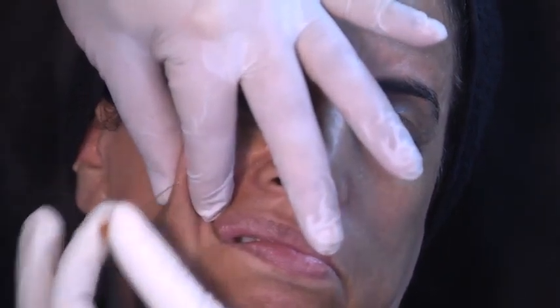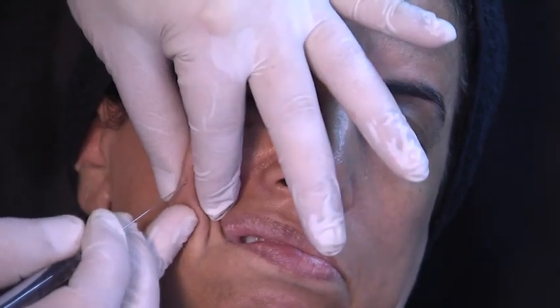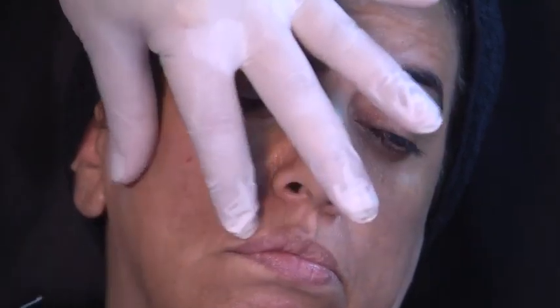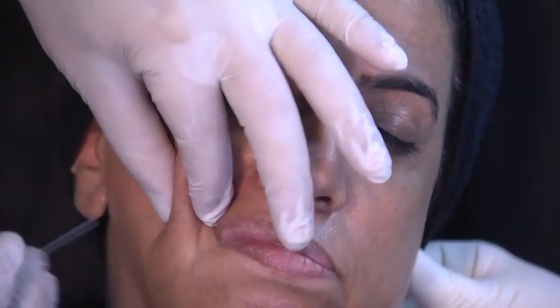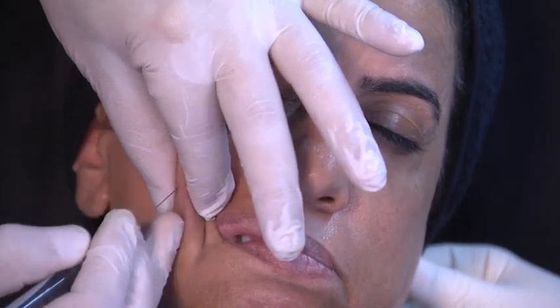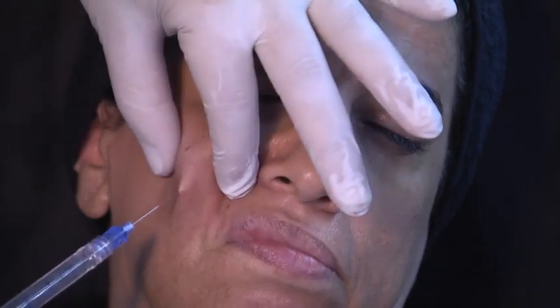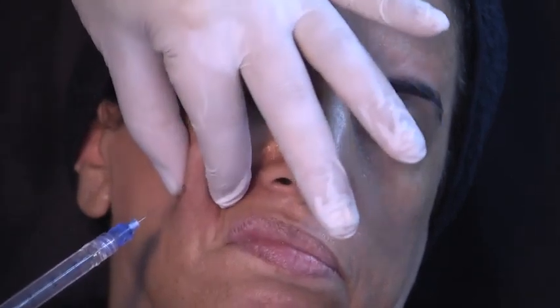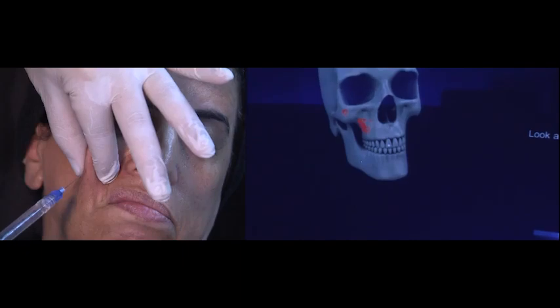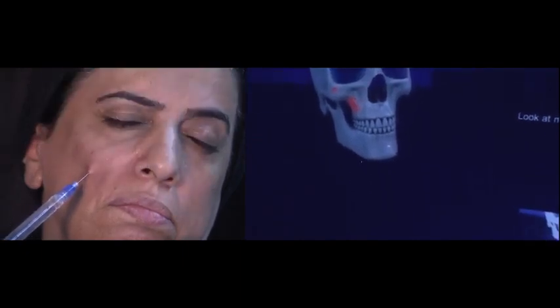So I'm going to do exactly the same that I did before. With my Restylane Volume, I will pinch the skin in the direction that I want. I have to tunnel in the same direction. This is Restylane Volume, and I'm going to go deep to the deep fat pads and bone, supraperiosteal. Wait for the bleeding. I don't see any bleeding here. Okay, there it is.